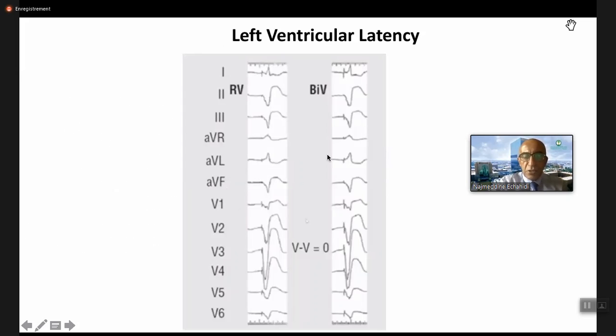You see here, this patient was meeting all the criteria for CRT and a device was implanted. Look carefully here at the biventricular pacing. The device was telling us that this patient is receiving biventricular pacing 100% of the time. However, while checking the RV threshold, you can see that there is no difference between biventricular pacing and RV pacing.